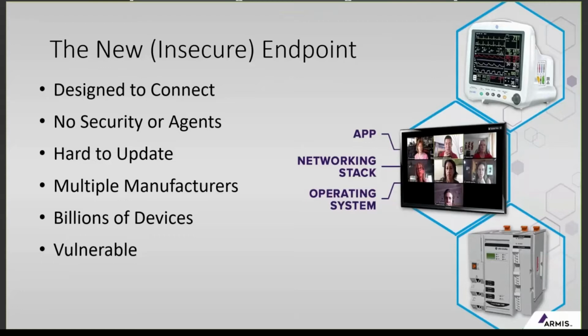So as you think about, even if there were patches made available, if hundreds of manufacturers were making those patches available, there is no central means of managing those patches. A lot of those patches are going to come out from different manufacturers with different steps, different guidance, requiring someone to have to weed through all of that, and it's almost impossible. We continue to see our customers struggle through working through that and looking at alternate solutions that can manage the risk without having to worry about all those patches.